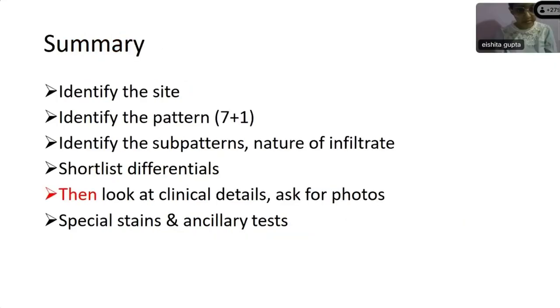So to summarize, try to identify the pattern, identify the sub-pattern, the nature of the infiltrate, make a short list of the differential diagnosis. And what I do is I do this and then look at the clinical details. I don't bias myself looking at the clinical details before I get an idea. So that's a good way to have a CPC. And please don't hesitate to ask for pictures, ask for additional information. And it's very, very important to have an open and healthy dialogue with your dermatologist so that both of you are on the same page, that you know what they mean and they know what you mean. So I think that's most important before we interpret skin biopsies.